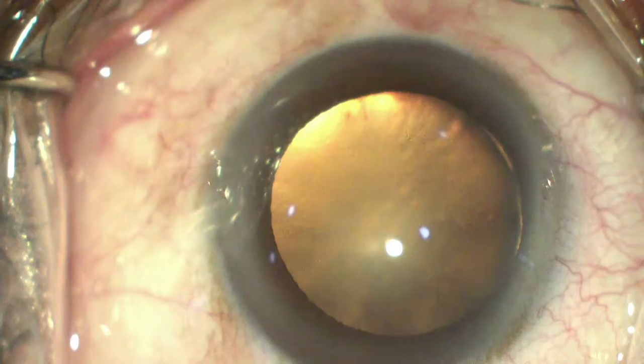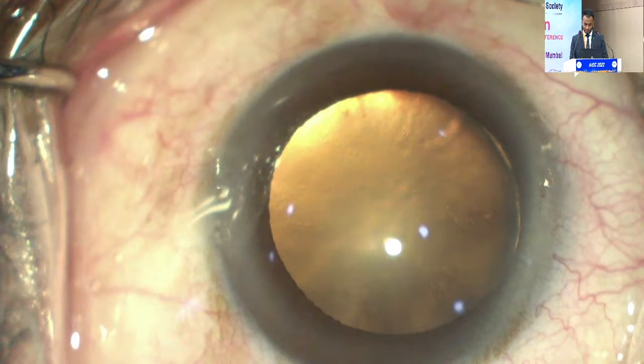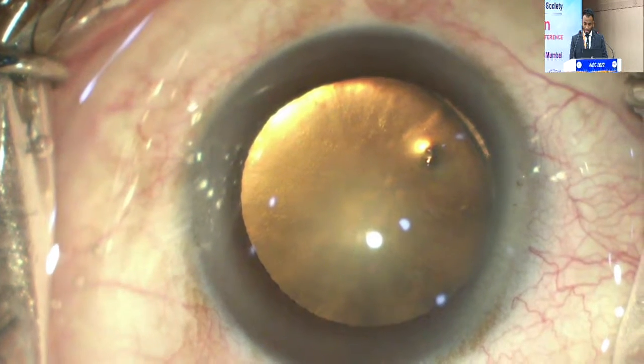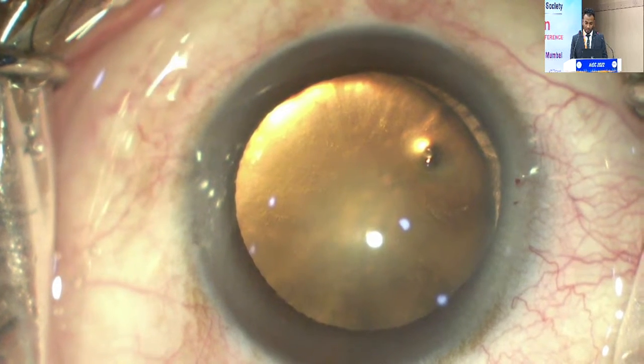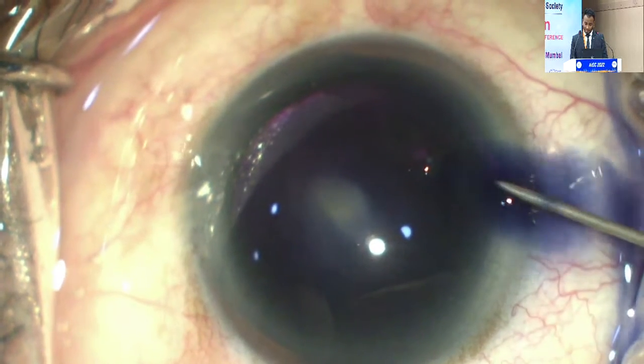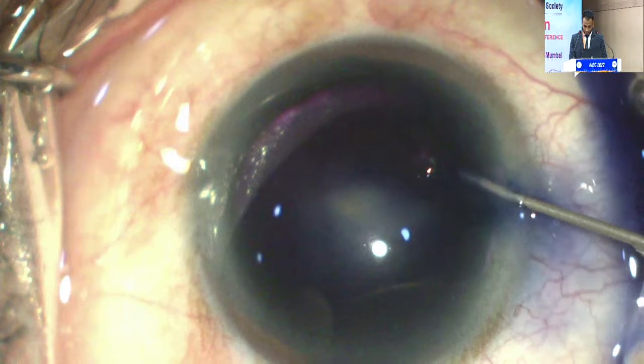Okay. So if you can see, subtly there's a zonular dialysis of around 3 clock hours. I put intracameral adrenaline, which reveals a little more than what I had expected, because on slit lamp it wasn't dilating. Trypan blue is an important step, as I said. What happens is I've put trypan blue. In this case, I'm not showing it, but now what I do is wherever the area of zonular dialysis is there, I put a cohesive viscoelastic so that the trypan blue doesn't go behind.